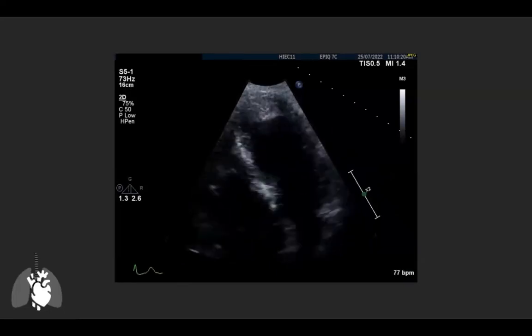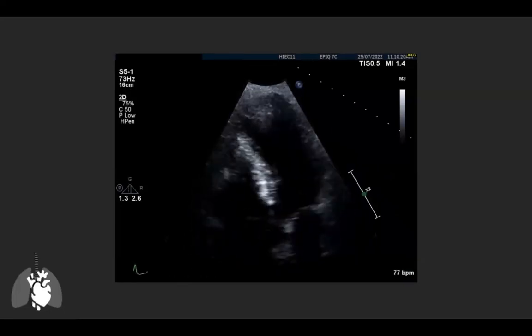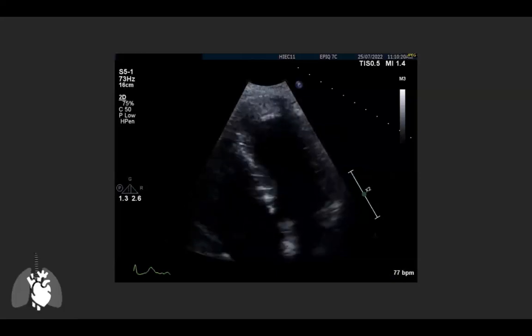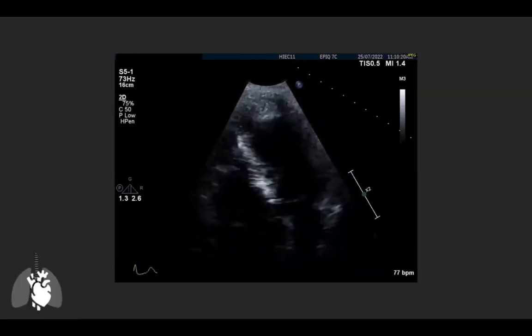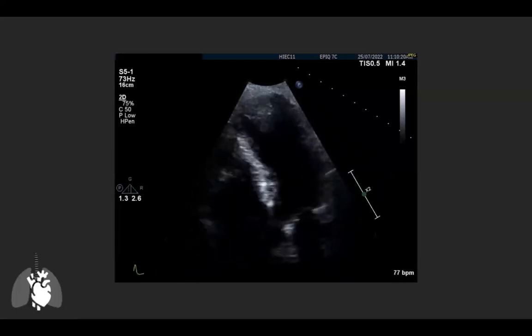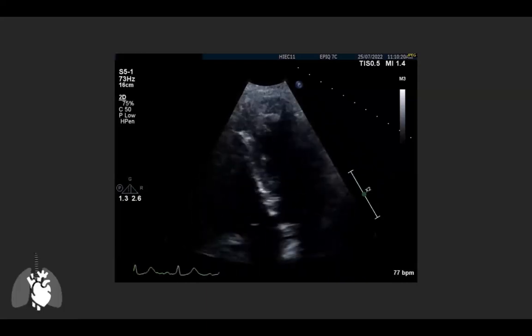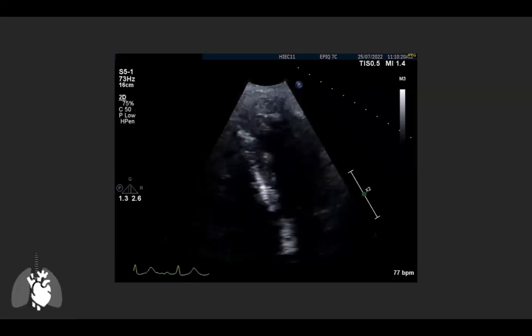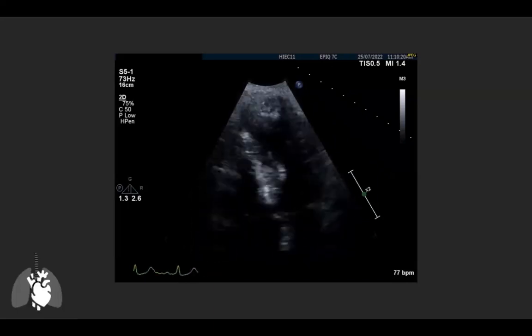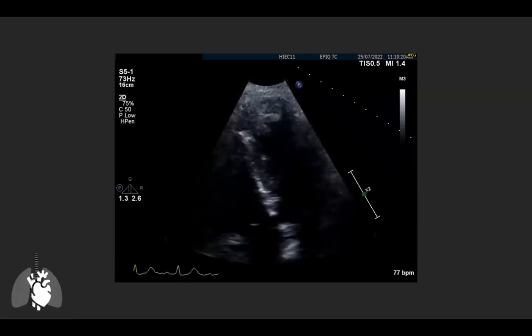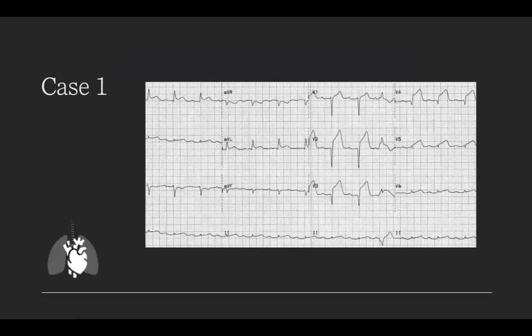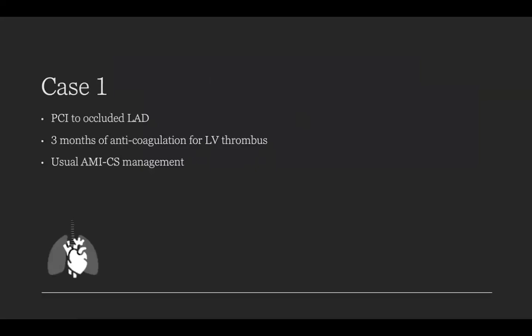Moving to the apical four-chamber view, the wall motion abnormality is even more pronounced. At the basal level, function appears close to normal, but out toward the apex there is no thickening during systole despite normal resting wall thickness. As an added finding, there is a large apical thrombus. Not surprisingly, this patient was found to have a large anterior STEMI and went for PCI to the occluded LAD. In addition to usual MI management, anticoagulation was required for the apical thrombus.